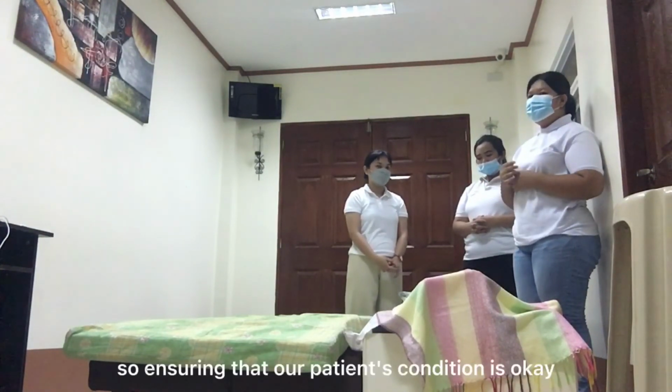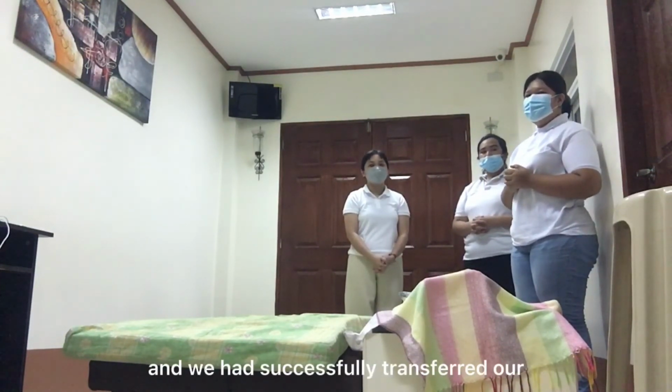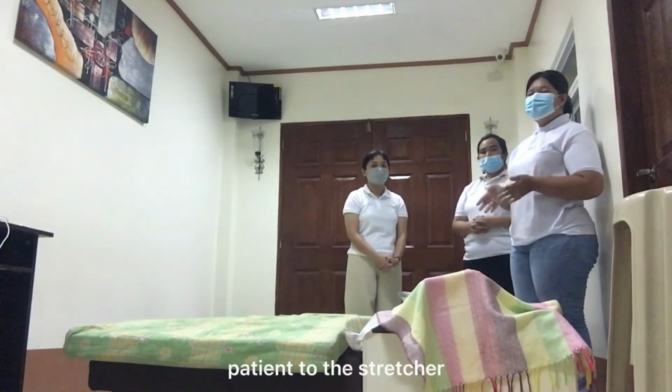So, ensuring that our patient's condition is okay, we can already document those observations, and we had successfully transferred our patient to the stretcher.